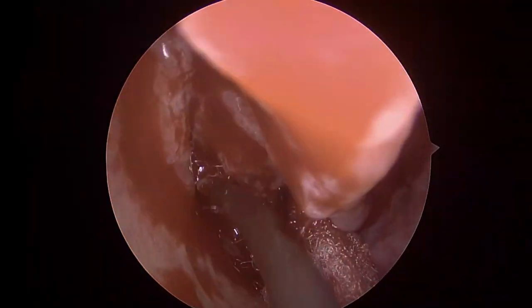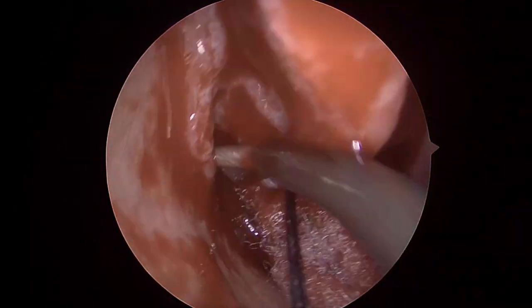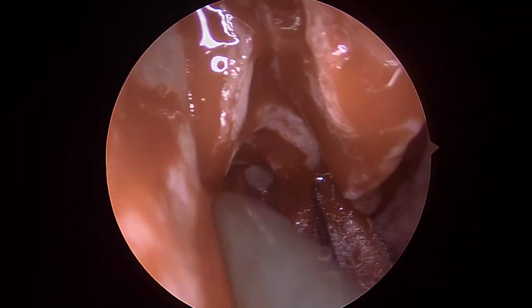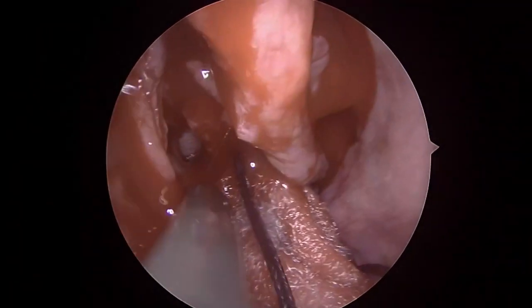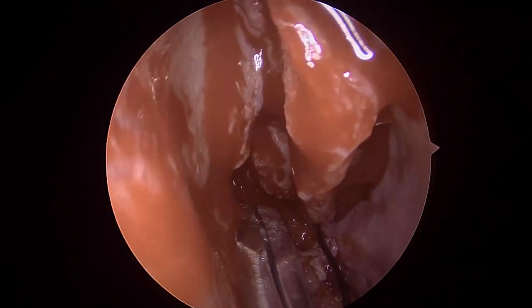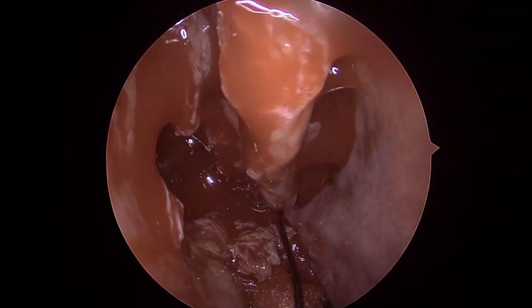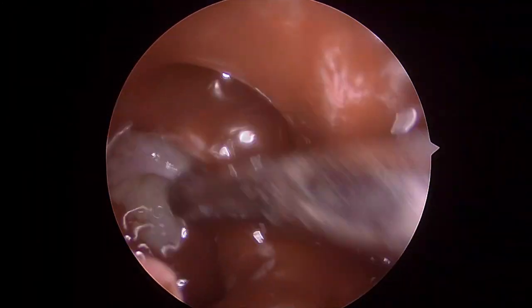So now I'm using a ball probe to try and get the free edge of the uncinate as well as trying to find where my maxillary ostium is. And once I've gotten the maxillary ostium, I use the hanging technique taught to me by Dr. T. N. Jankiram sir, where I dislocate the horizontal portion of the uncinate and then I use a Toti's backbiter to take two bites at the junction of the vertical and the horizontal uncinate.